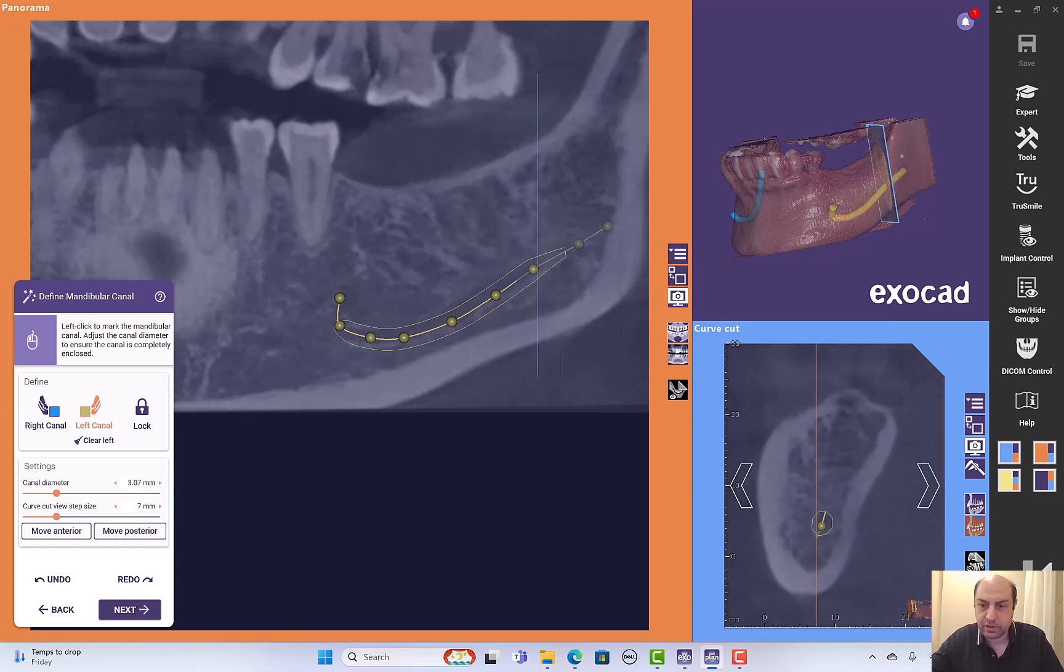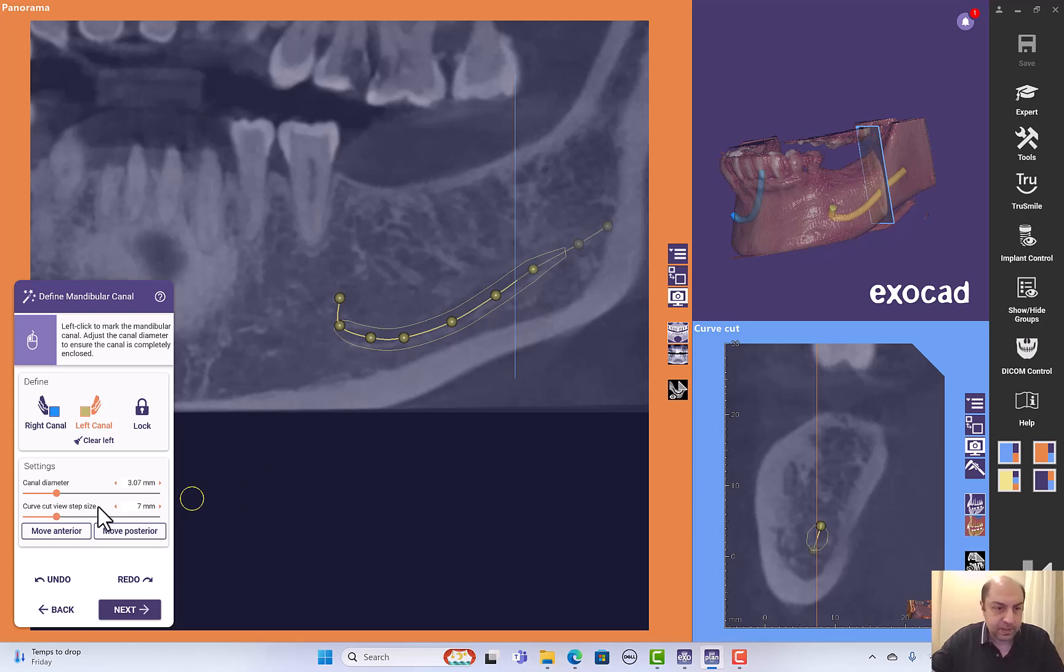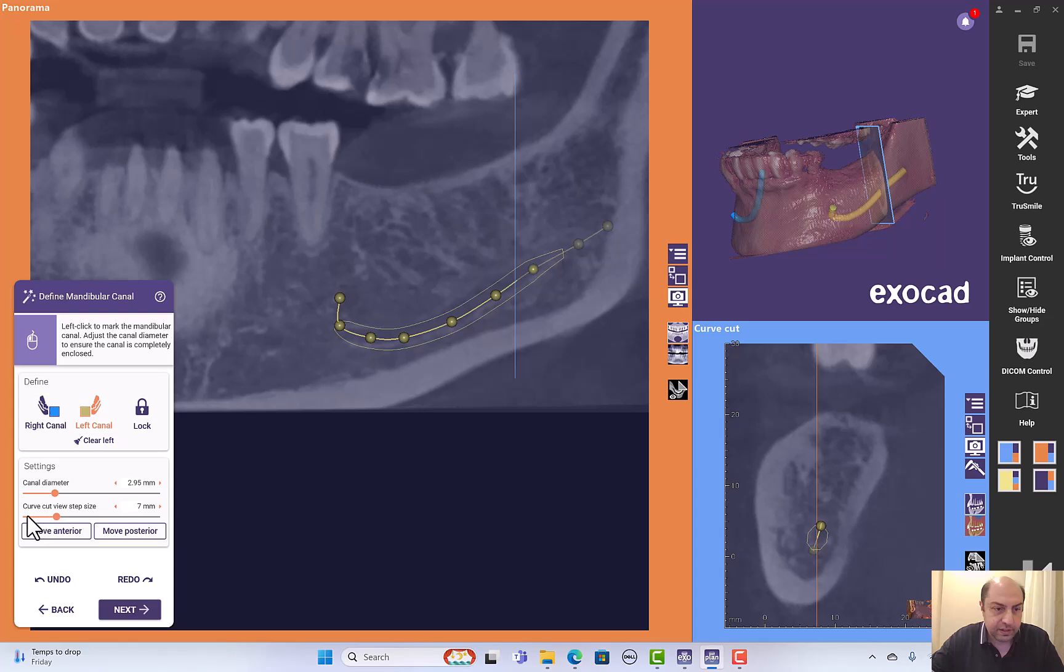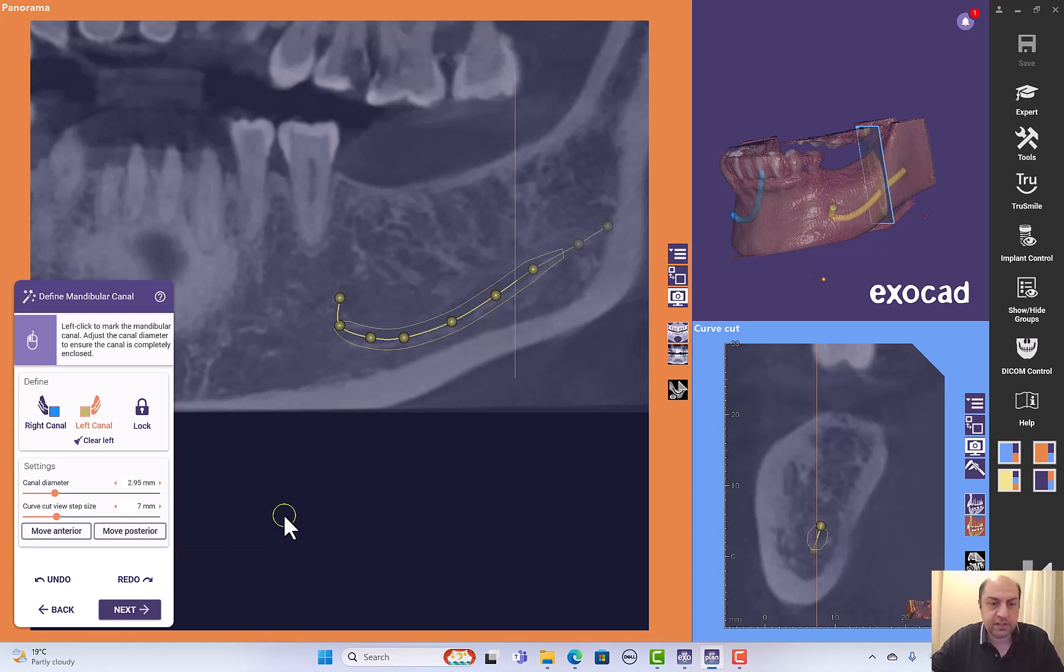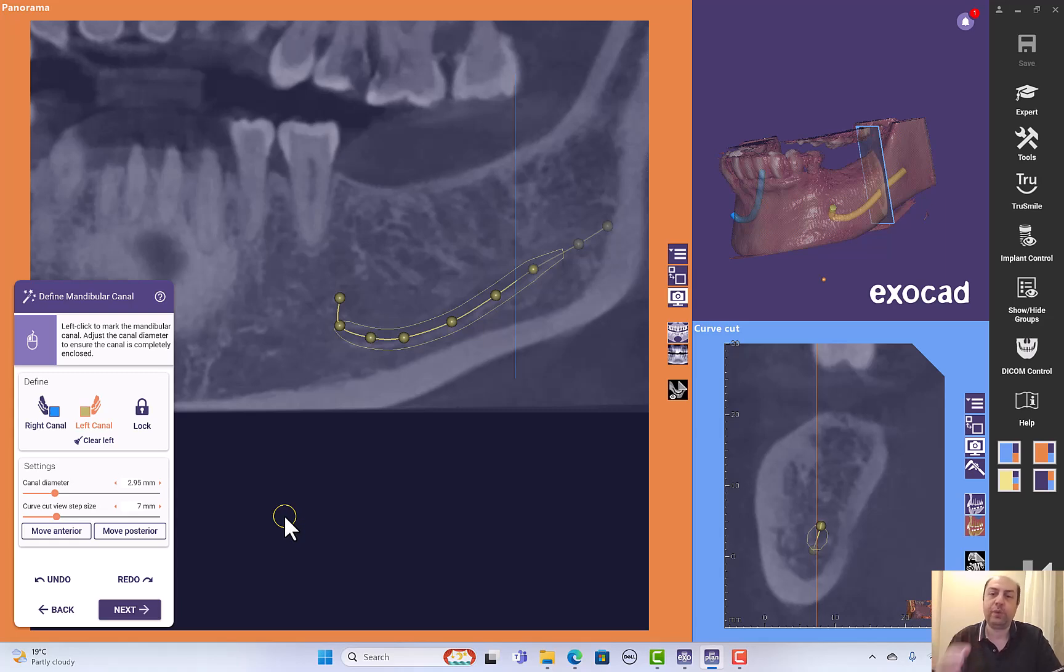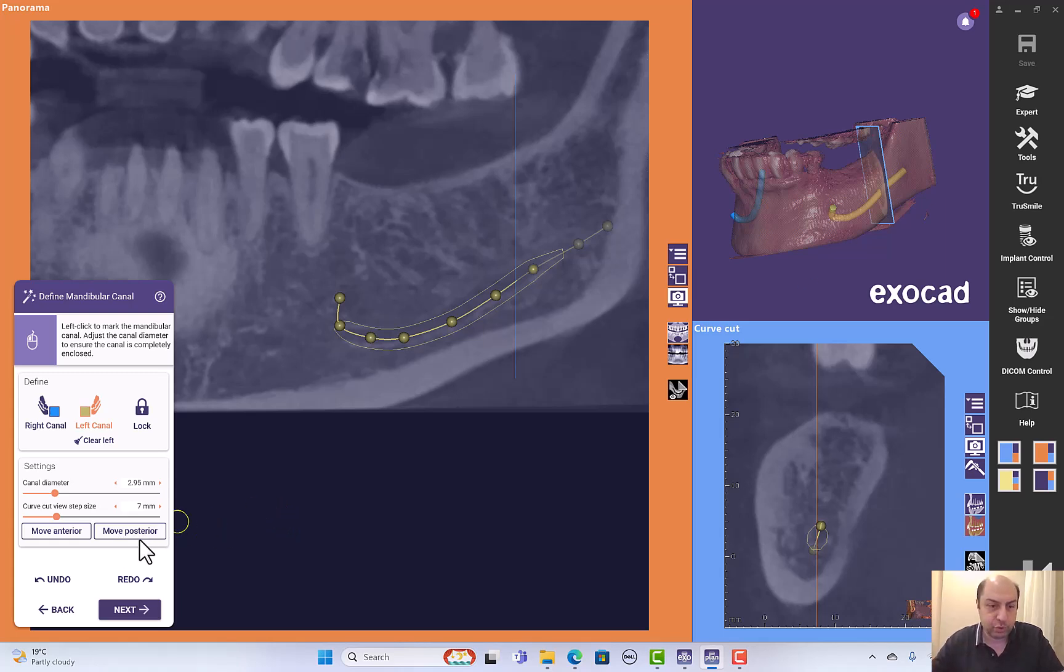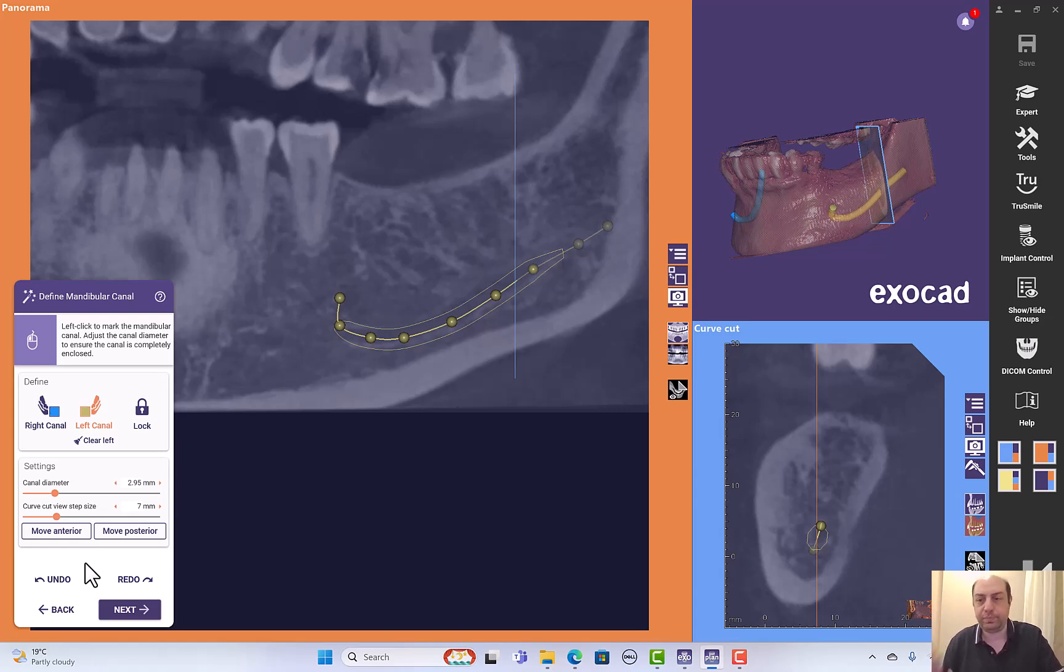Here is the diameter if I want to decrease the diameter slightly. Curve cut view step size - this is to know how you can skip areas. For example, you're going to put one point and you can skip few millimeters and put the other point, either using shift or by pressing move posterior or move anterior according to your position. If you are in the mental foramen area you press move posterior. If you are at the mandibular canal beginning you can choose to move anterior.